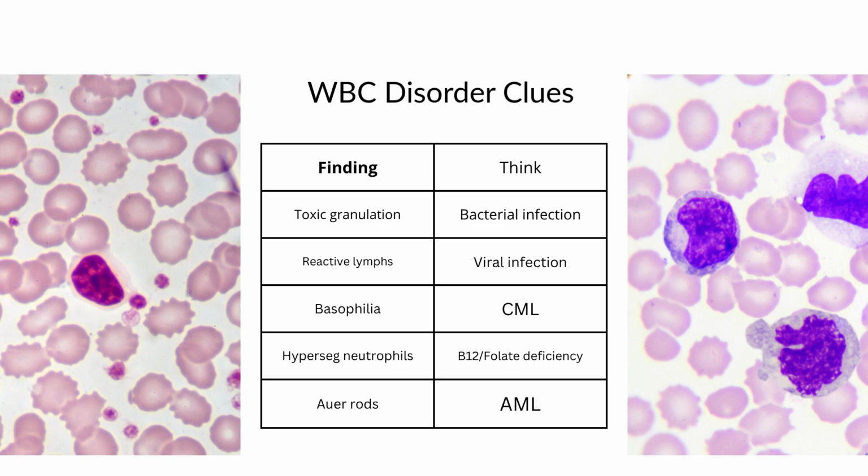Smudge cells, classic CLL. See that in a lot of older people, and we see that in babies because their lymphocytes are fragile, and that can rupture during slide preparation. And that's why we see them, and that's why sometimes we put albumin in there to keep the cells together. Isn't that crazy? I learn something new all the time.